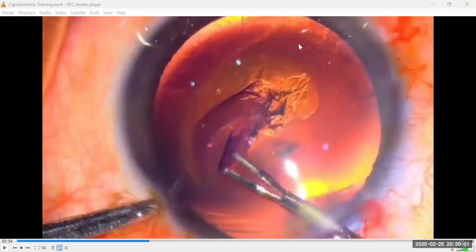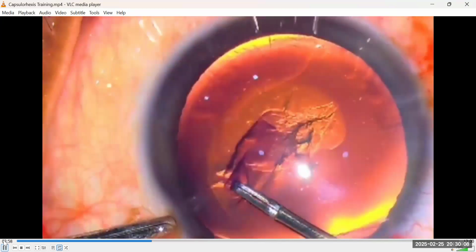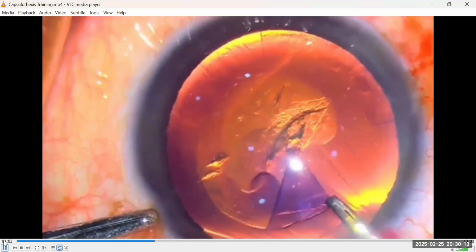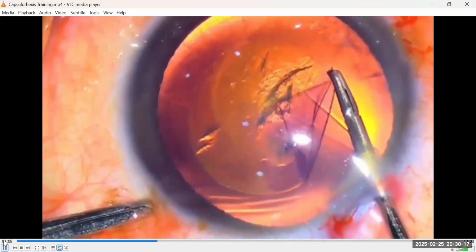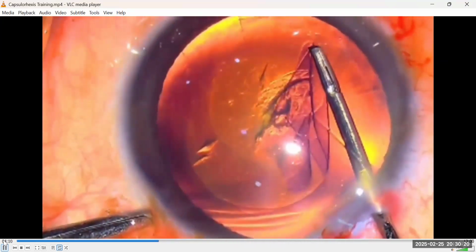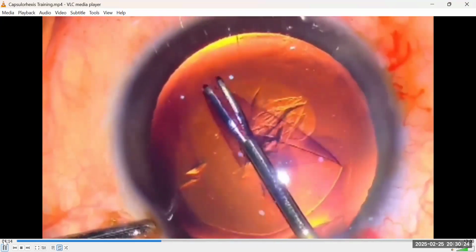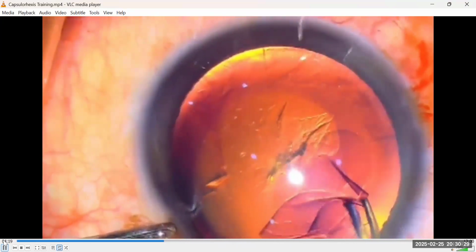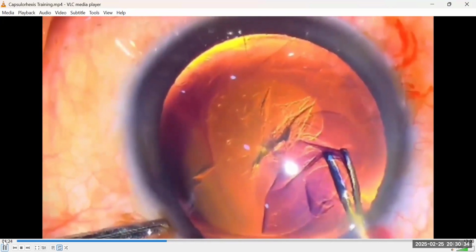Okay, so let's play this and continue. So I move it to where I can see it. The flap is getting longer. Pi r squared. Then I stop where I can easily pick it back. Oh, I went across. All right, this is actually what it should be, but it's wrong. Don't have a longer flap. Always remember pi r squared.